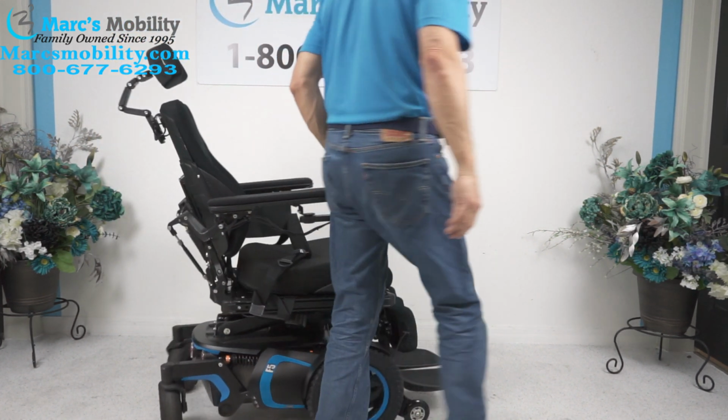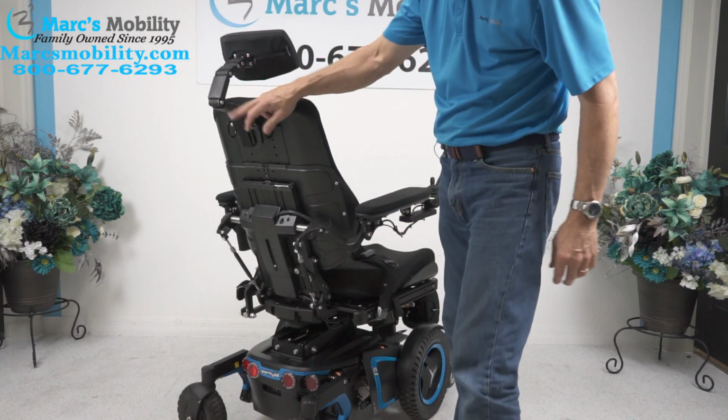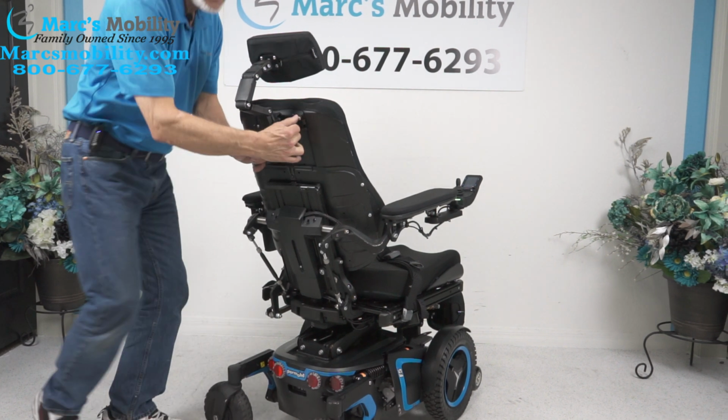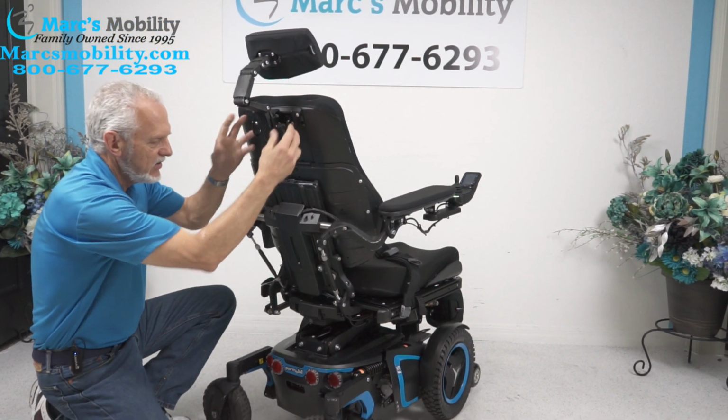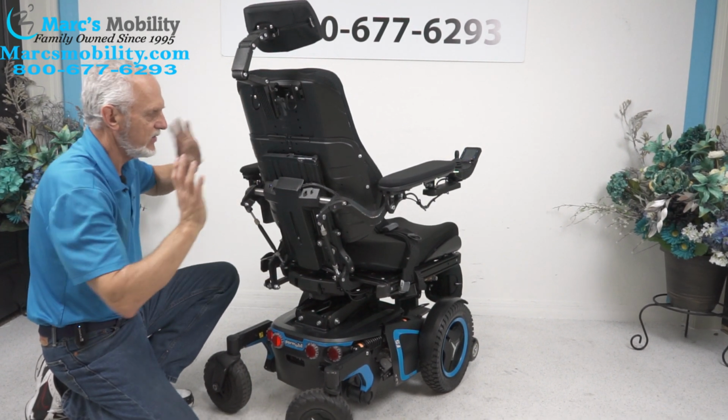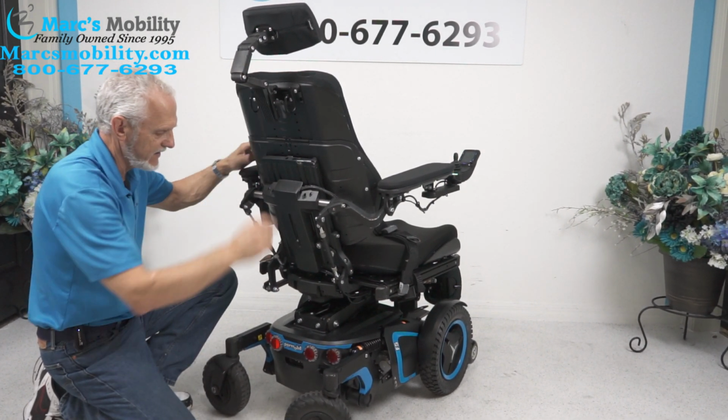In the back of the chair, you have your adjustable headrest, fully adjustable. You have two hooks right here if you want to put a backpack. But remember, if you put a backpack on here, make sure anything hanging down doesn't get caught up when you recline. It's okay when you're going down the road, the back is up. So just be careful with these.